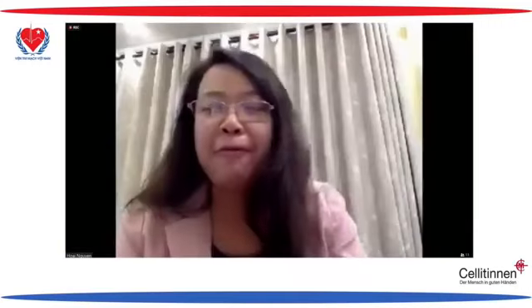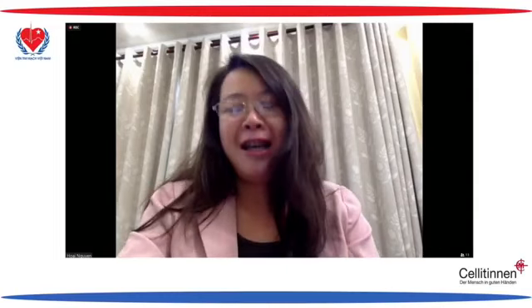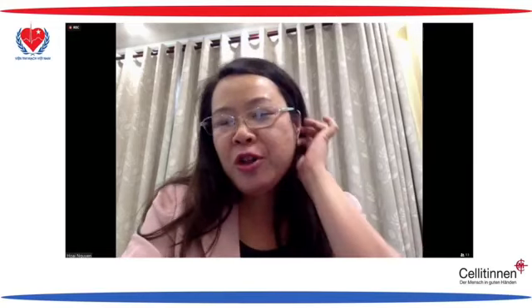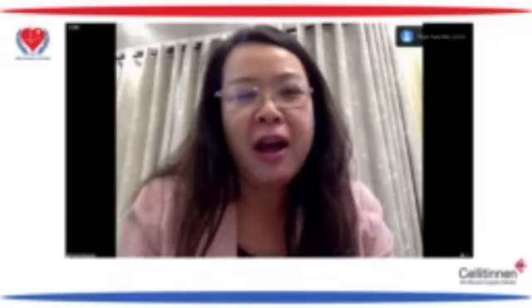Thank you, Dr. Bao, for your wonderful presentation on 3D TEE in assessing tricuspid valve. My question is regarding the annulus of the tricuspid valve. When you assess the annulus, do you use unfolded view or flexi slice or quantification software, to define what is the annulus?